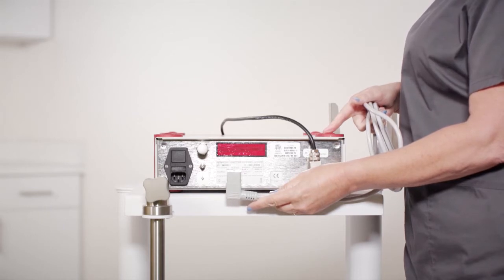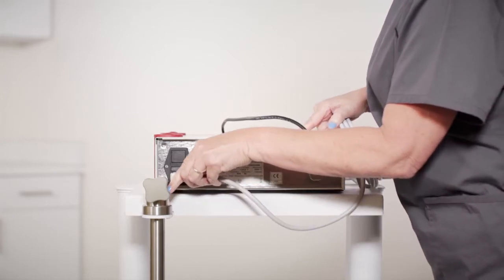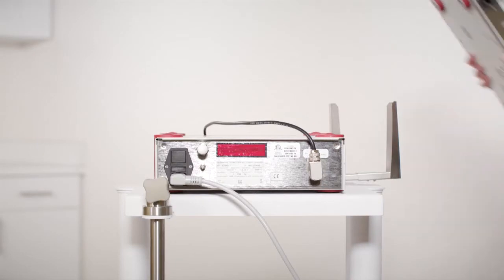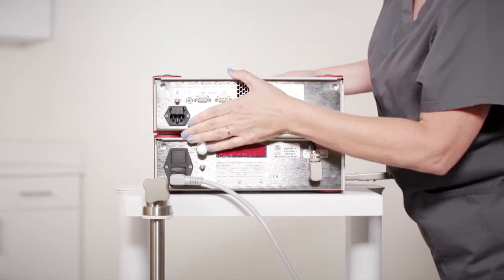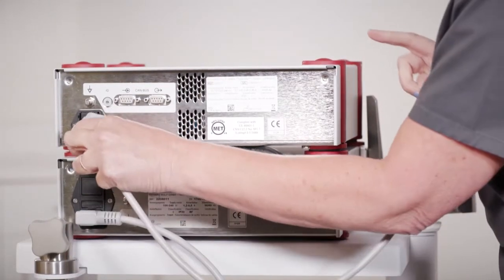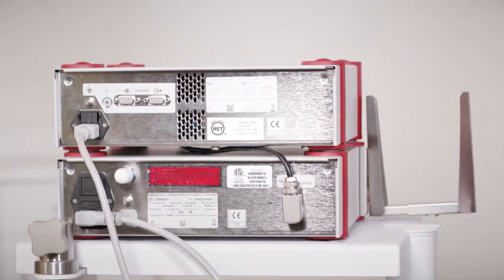Then connect the power cord to the suction pump unit. With the connection cable in place, stack the motor unit on top of the suction pump unit. Connect the power cord to the motor unit. Note that each unit has its own power cord.